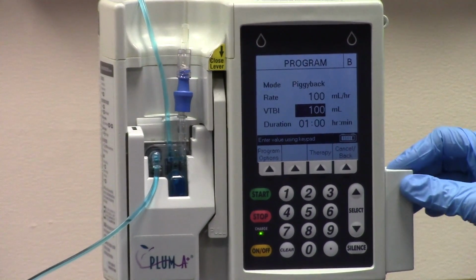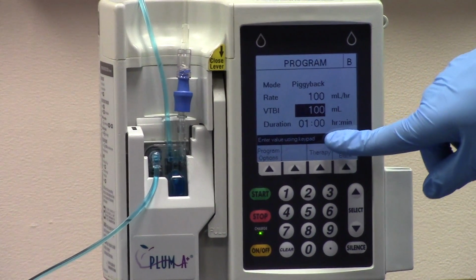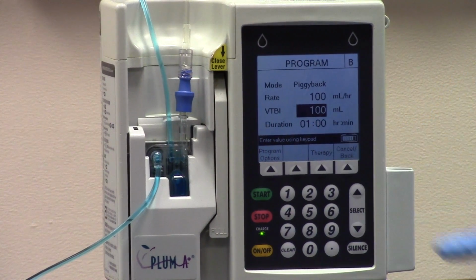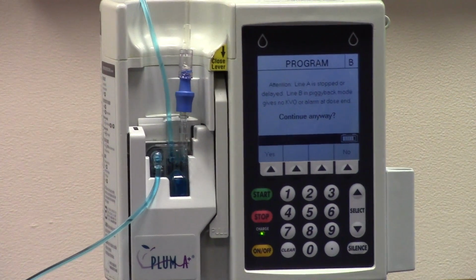And then if you want a safety to check your math that this will go in over an hour, it also tells you that it goes in over an hour. So if you've done your calculation wrong, it will tell you the time frame you've programmed. So I'm happy with that, so now I'll hit start.